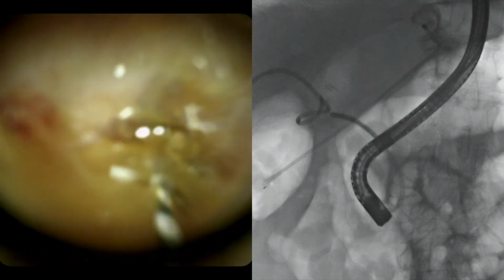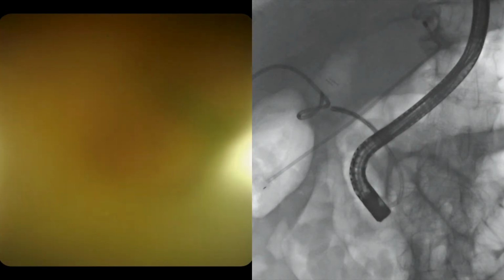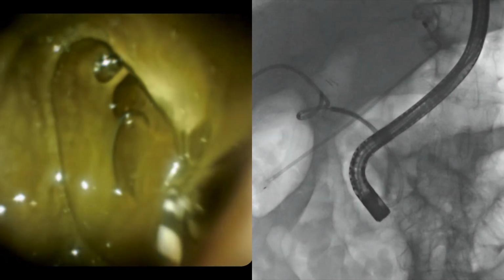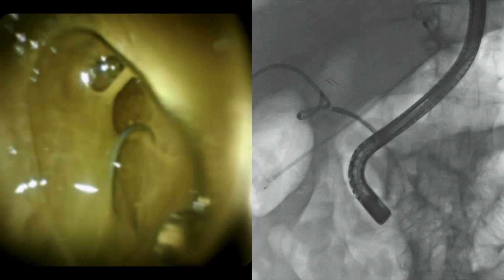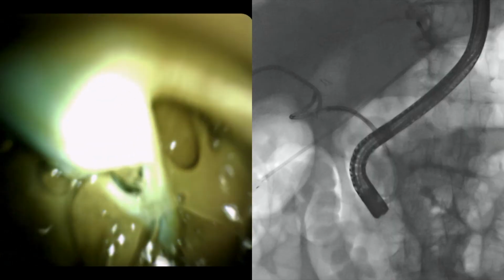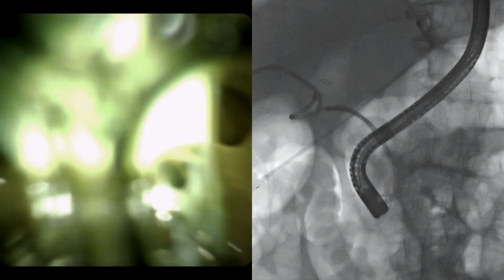A digital single operator cholangioscope was advanced over a guide wire through the common bile duct and across the site of bile duct transection. We were able to access the subhepatic fluid collection where the percutaneous locking loop catheter could be visualized. The cavity was explored using the cholangioscope, and a side hole was identified on the looped portion of the percutaneous biliary drain.